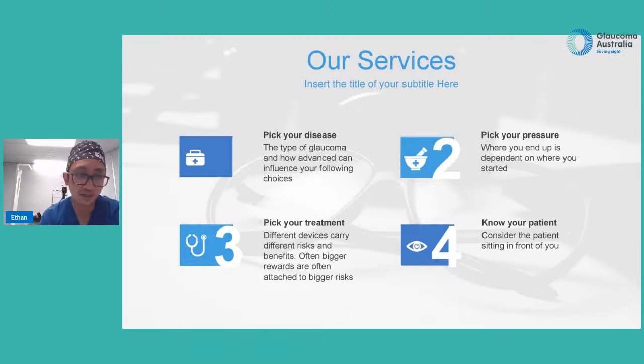So they're the common devices on the market at the moment. There are some other ones. They all work in fairly similar fashion, but these are the most popular ones and the ones you're most likely to be offered by your glaucoma surgeon, and in some circumstances like the Eye Stent, even by a generalist or cataract surgeon.